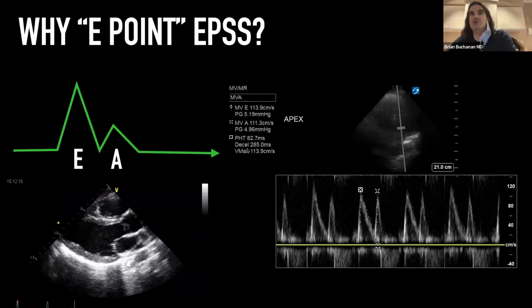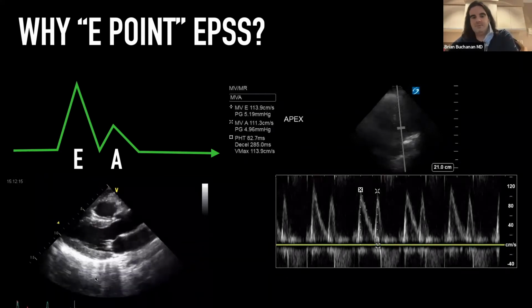Yeah, so aortic regurgitation for sure can impinge on that valve. This is a super nerdy take, but you can have what's called an Austin Flint murmur, where the aortic regurg hits the anterior leaflet, kind of closes it, and you get a functional mitral stenosis. Super nerdy, but kind of cool from an echo standpoint. The valve is tight, right? If the valve is stenotic and you have mitral stenosis, then obviously that valve's going to move less. Same with a calcified valve and what have you.